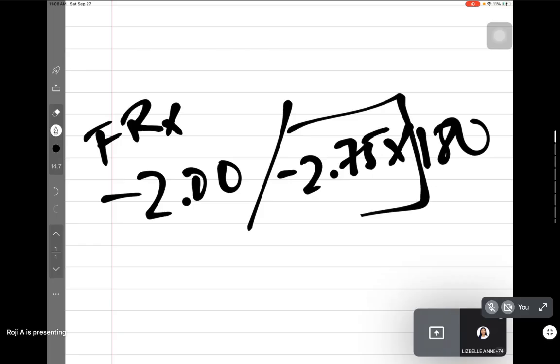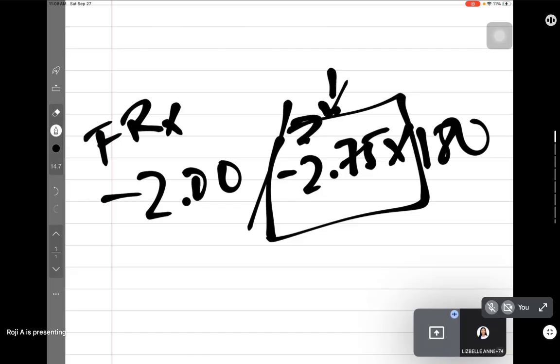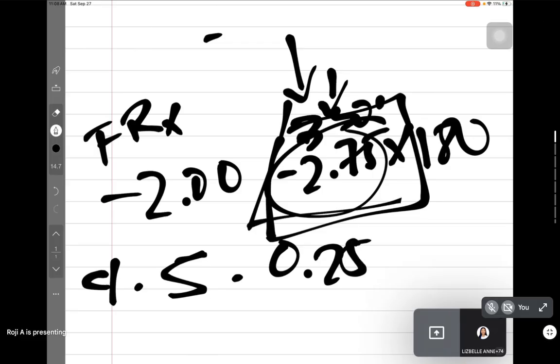Hindi po siya magiging minus 2.5? Technically, as I've said, if you see that there's a reduction, unless otherwise, when by computation this remains at 3, then you use the least minus because you already see that there's a reduction, which is 5. Actually, there is an estimation. 4 to 5 plus or minus will have a reduction or addition of 0.25.